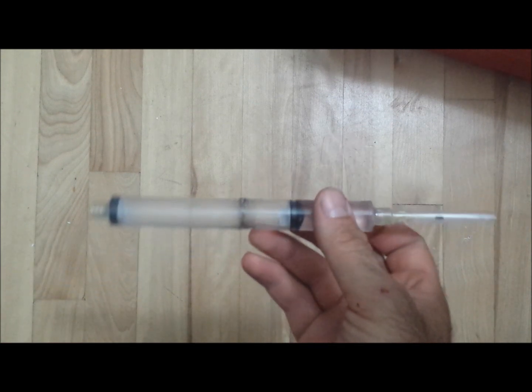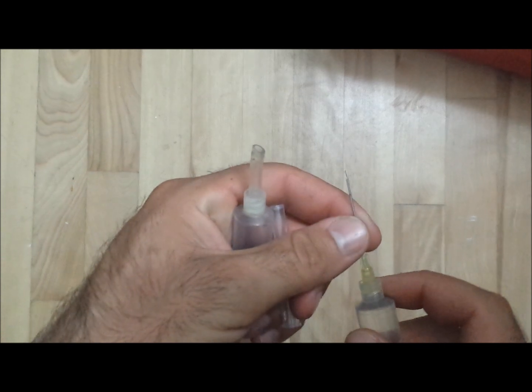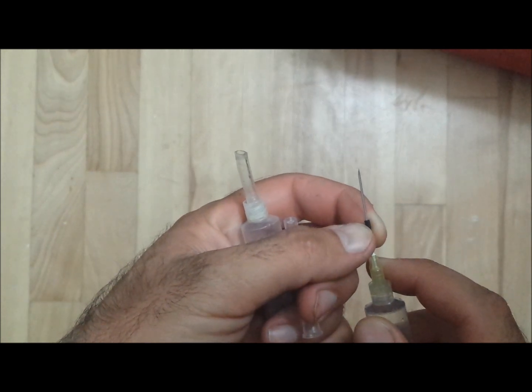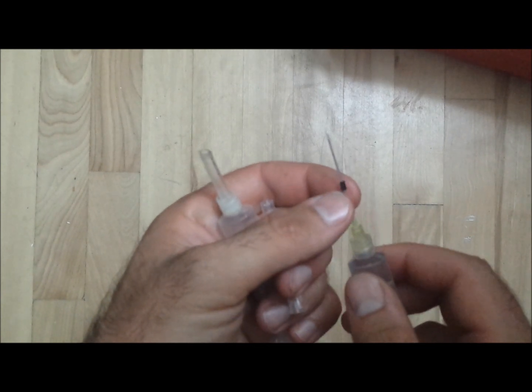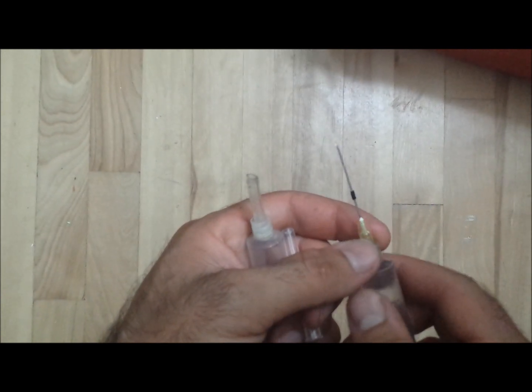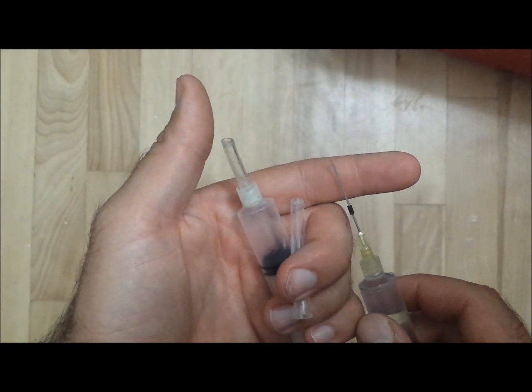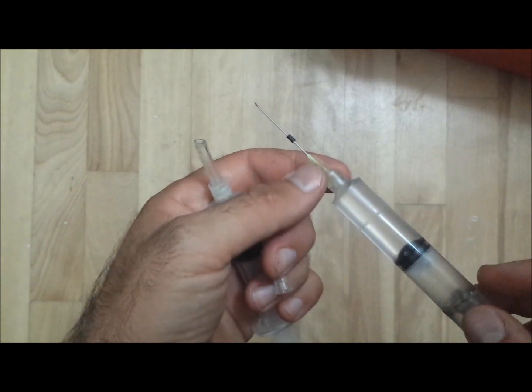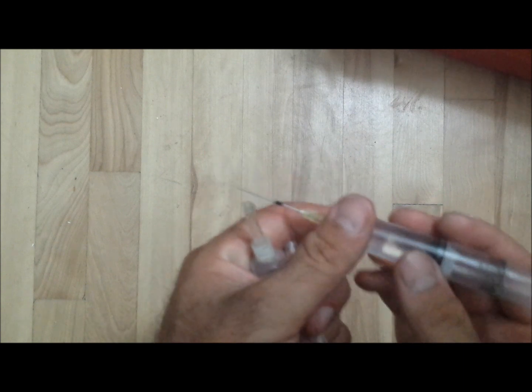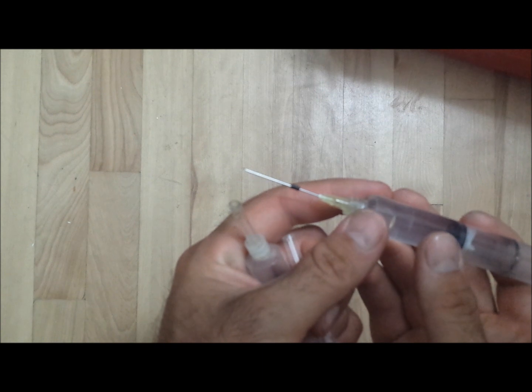To build one of these you need two syringes and one needle, as you can see right here. This is a piece of wire insulation. This is a standard needle that you get with these syringes. This second one, if I'm not mistaken, was for putting scent in dog toys for hunting.